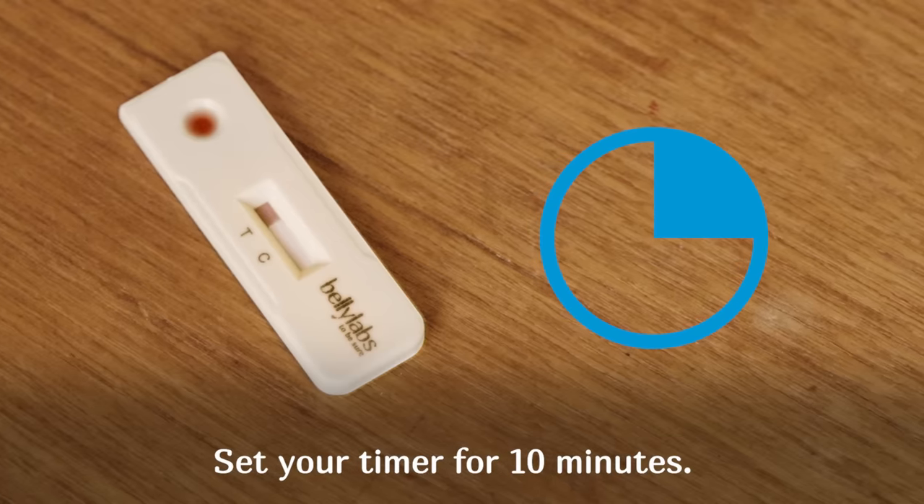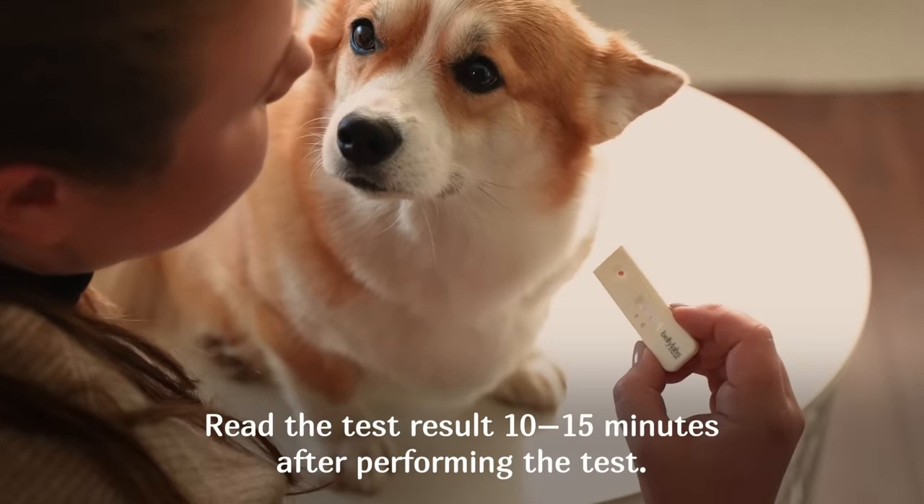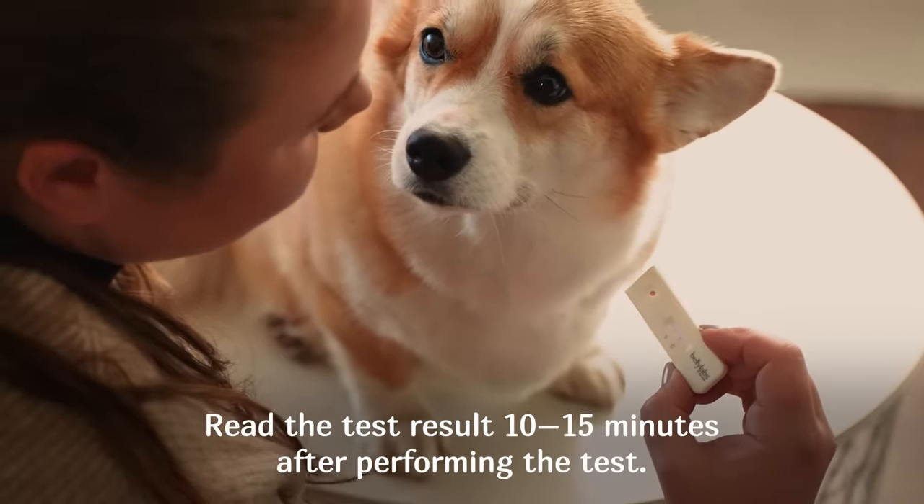Set your timer for 10 minutes. Read the test result 10 to 15 minutes after performing the test.